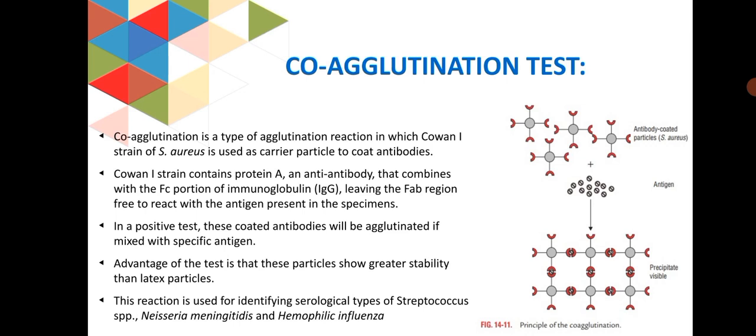Advantage of the test is that these particles show greater stability than latex particles. This reaction is used for identifying serological types of Streptococcus species, Neisseria meningitidis, and Haemophilus influenzae.